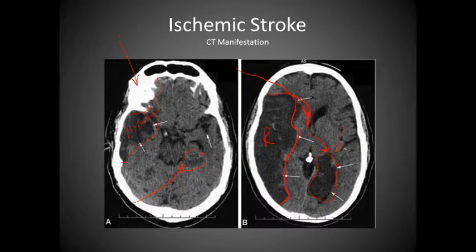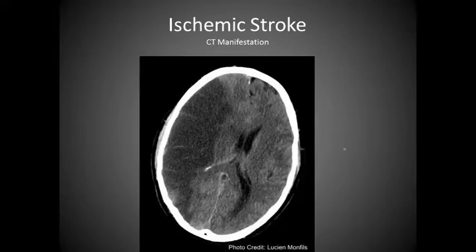However, because we have this area on the left side, there could be bilateral weakness as well. Notice how hypodense it is, how black it is in comparison to the other portions of the brain. That's typically what you're looking for, is just this hypodense area. We don't get so caught up in a triangle-shaped area or things like that. But once you see an ischemic stroke, you usually will know what to look for from that point on.